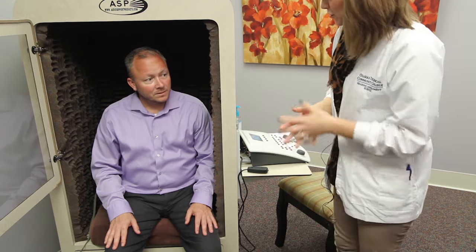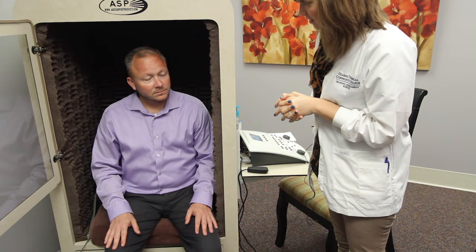Today we'll be doing air conduction testing, which is the basic threshold test for auditory pathways. Mr. Ruthabuck, I'm going to do some hearing tests on you today and we're going to start with pure tone testing. I'm going to put these inserts into your ear canals and you're going to hear a series of tones. The tones are going to get softer and softer until you can't hear them anymore, and all I need for you to do is push this button when you hear the tone. Do you have any questions?